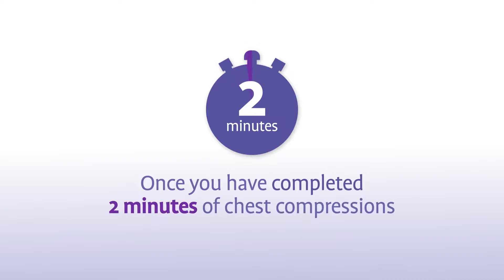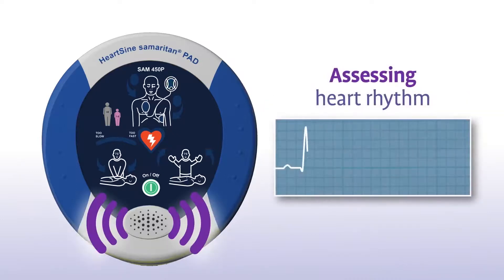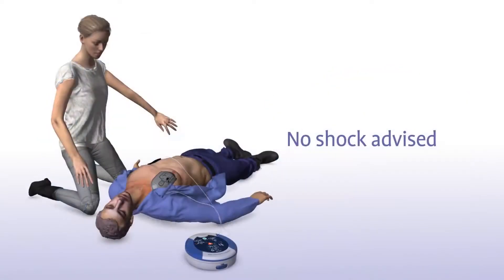Once you have completed 2 minutes of chest compressions, the SAM 450P will prompt you to stop chest compressions and again assess the patient's heart rhythm. Sometimes no shock is needed; the device will indicate "No shock advised" and advise you to continue performing CPR.